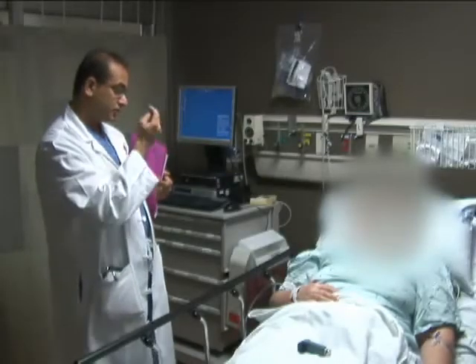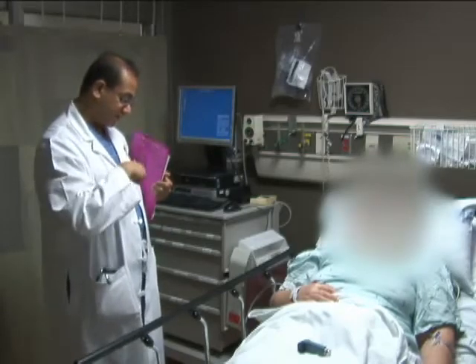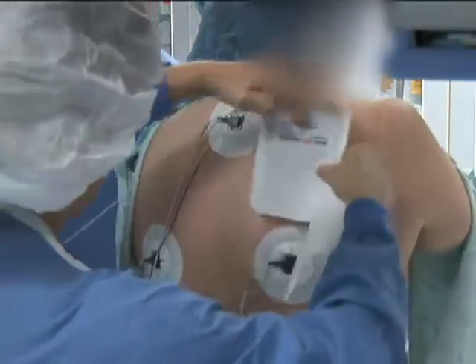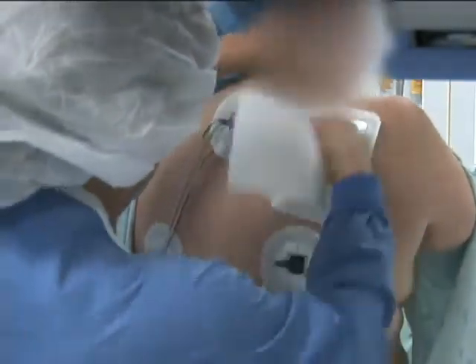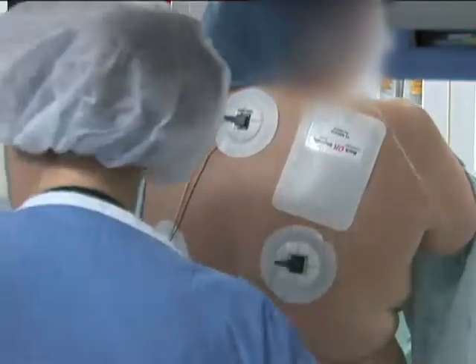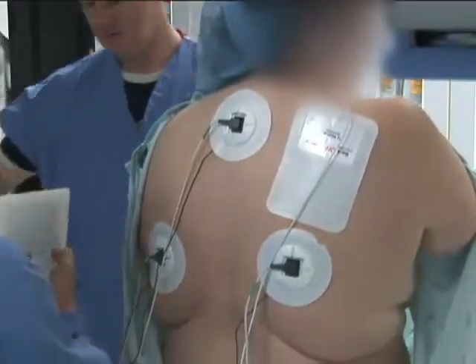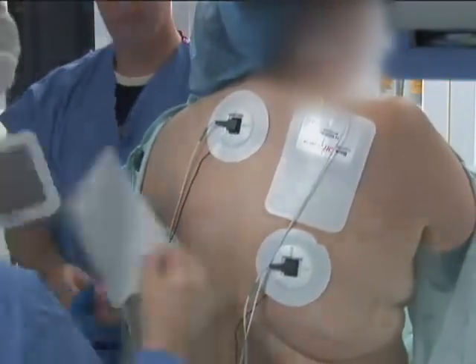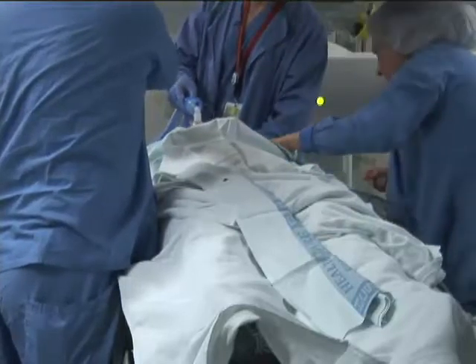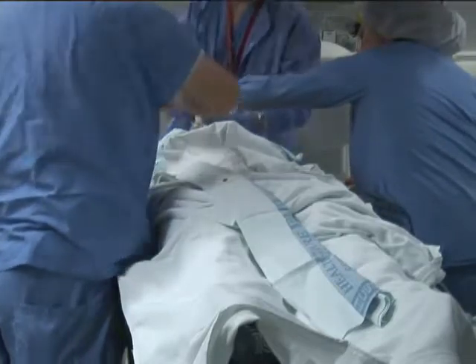Informed consent is obtained while discussing the plan for the procedure as well as the risks involved. The patient is brought into the electrophysiology laboratory, and defibrillation patches, grounding pads, ECG leads, blood pressure cuff, oxygen saturation monitor, and 3-dimensional mapping system patches are applied. Conscious sedation, or in this case, general anesthesia, may be used as determined by physician and patient preference.